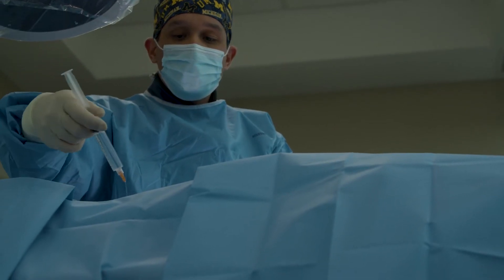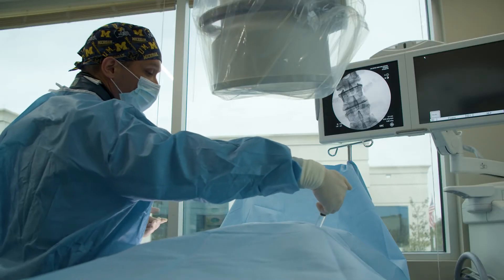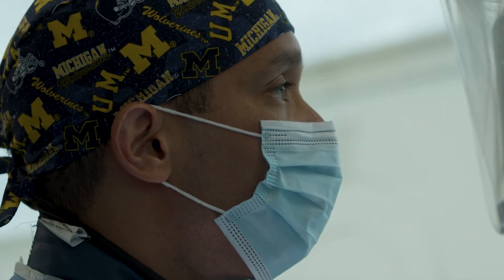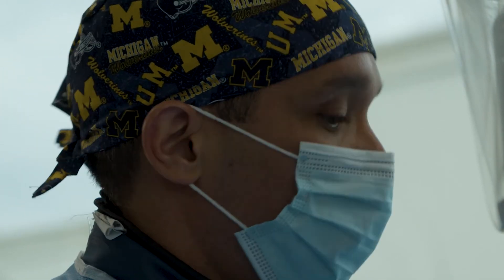As the procedure starts, we will anesthetize or numb up the skin over the area that we're going to be working. We're using live x-ray during this procedure, so it's important for us to know exactly where we're going to be working, and with that x-ray we can numb the entire area and make this procedure as pain-free as possible.